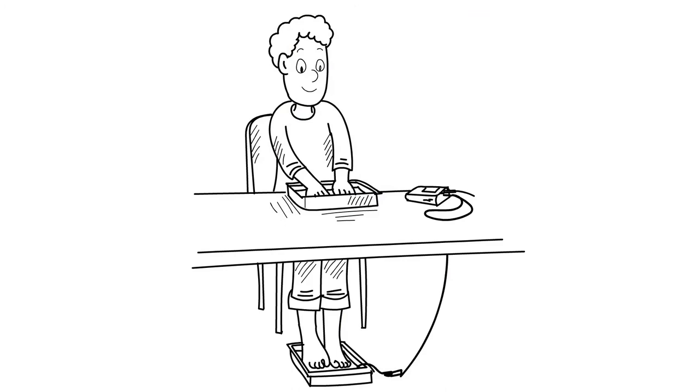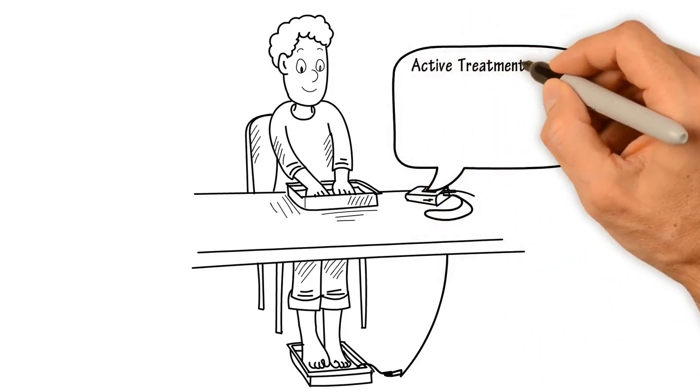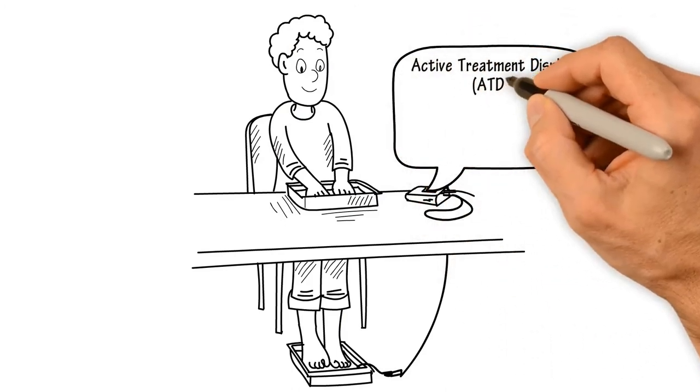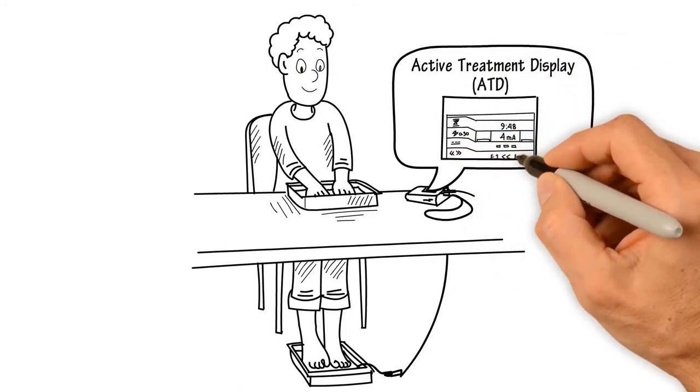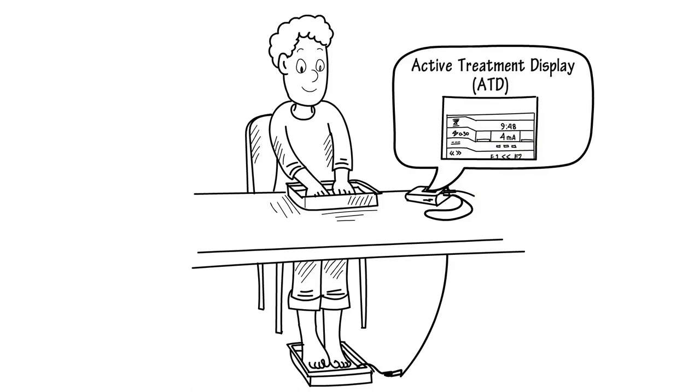Step 13: On the main control unit, you'll notice the active treatment display (ATD) light up with two bars. These display in real time that the treatment is working and when you've reached the preset power level.